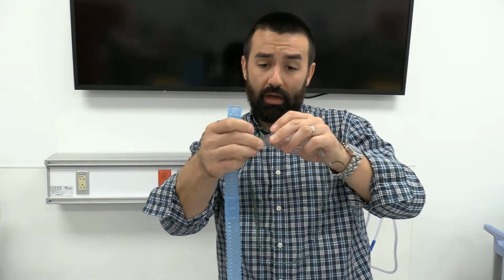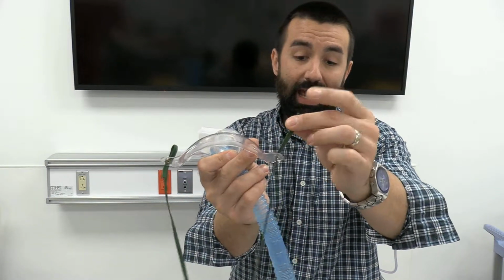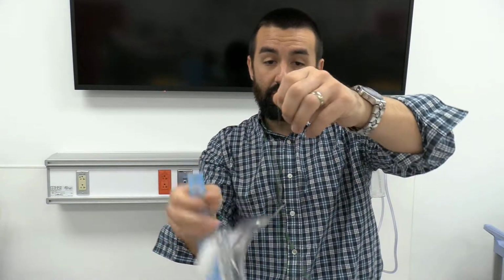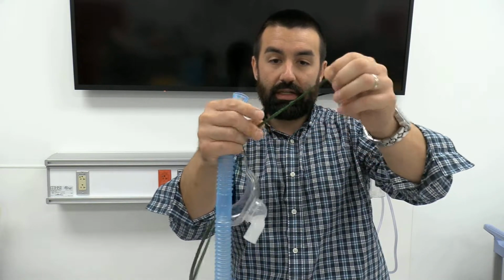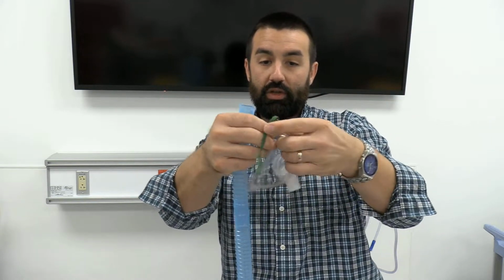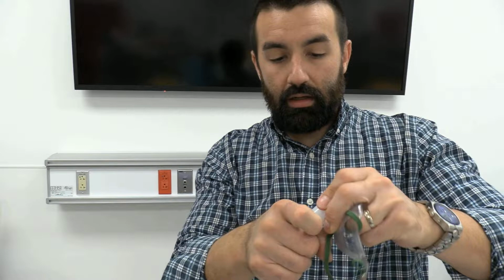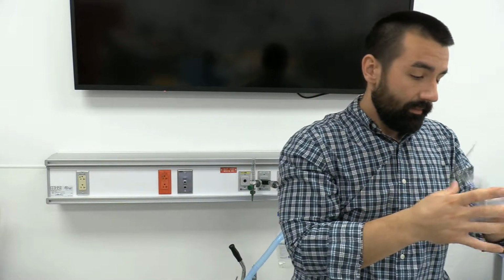Okay, so the other ones, they're kind of fixed on both sides, but you still have that kind of tag in. Especially when you're looping these behind people's head, I'd recommend kind of tying a little knot in the end here so somebody doesn't pull that out. I'm going to do so kind of here right now. You can see it doesn't have to be anything crazy. It's just so that doesn't get pulled out here. You got a tiny little exhalation port here, okay? Same deal. This is just going to kind of sit over their tracheostomy, and you kind of go ahead and tighten this up a little bit, and it kind of sits right on their trach.